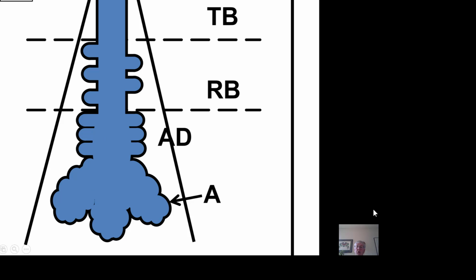In this cartoon, it shows that the structure of an acinus, if one did a 3-dimensional reconstruction, is roughly pyramidal in shape. There's the terminal membranous bronchiole, respiratory bronchioles, alveolar ducts, alveolar saccules, and alveoli. Of course, it's extending out on both sides of the z-axis of this slide, giving you this roughly pyramidal shape.